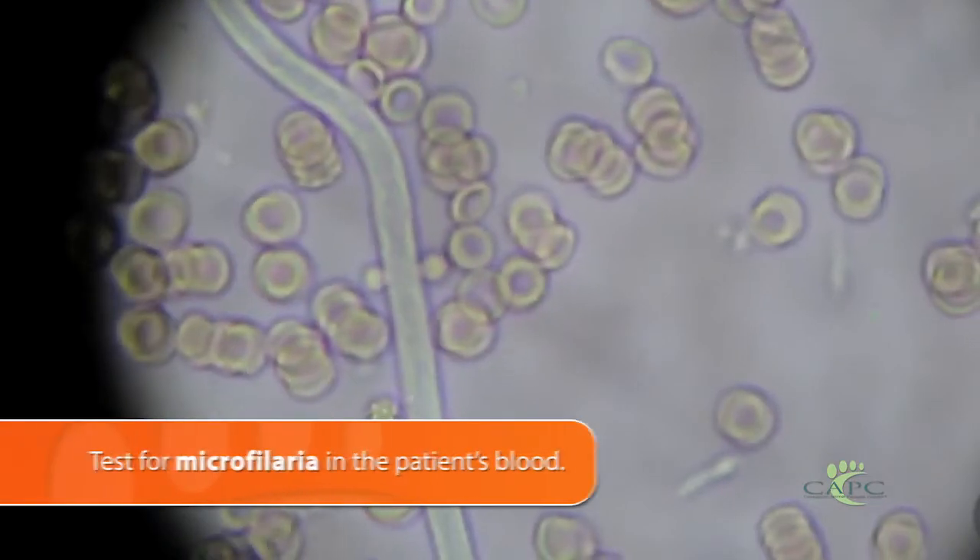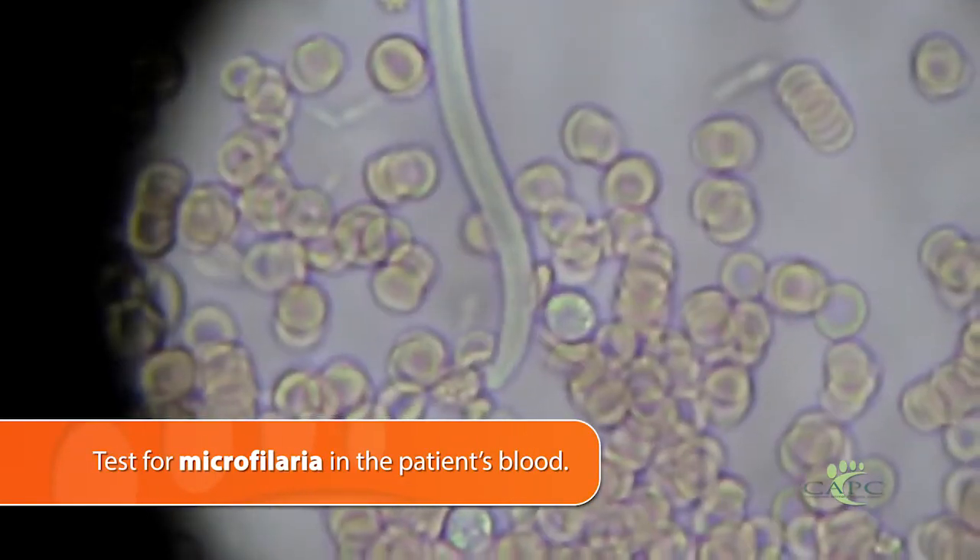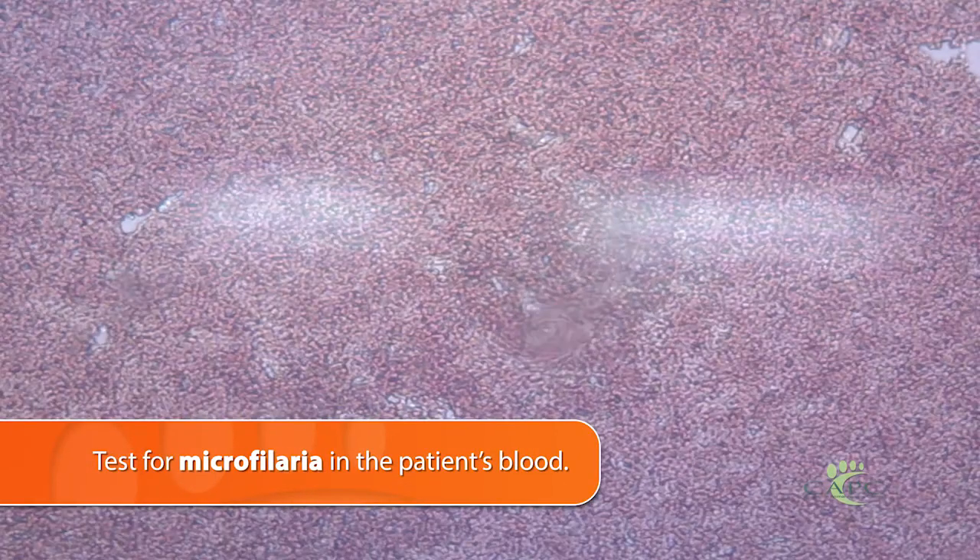But there's also just looking in the blood of the pet for the microfilaria — the larvae, what we sometimes call baby worms of the adult heartworms — and those will actually be swimming in the circulation.